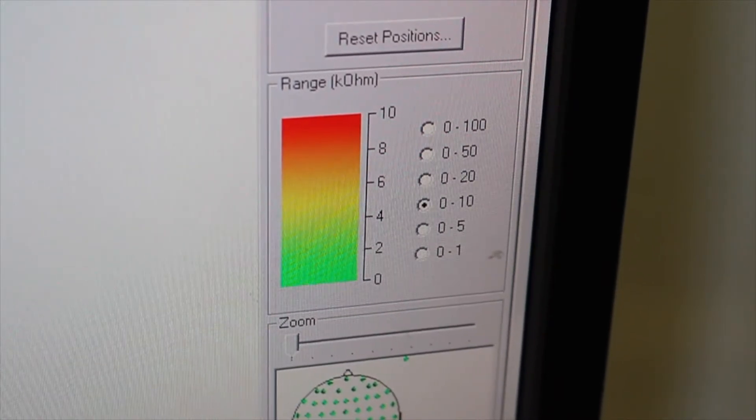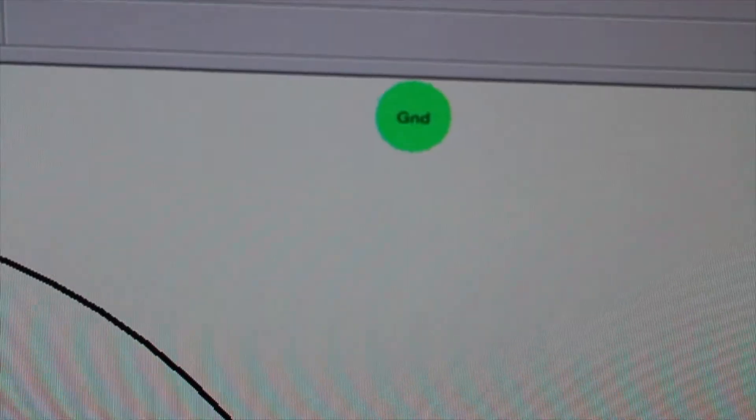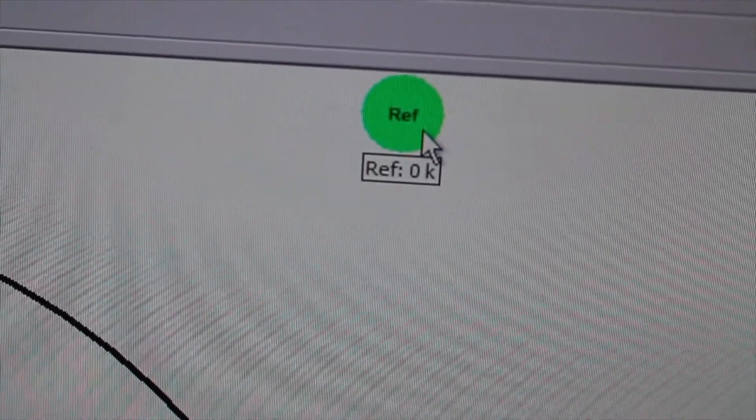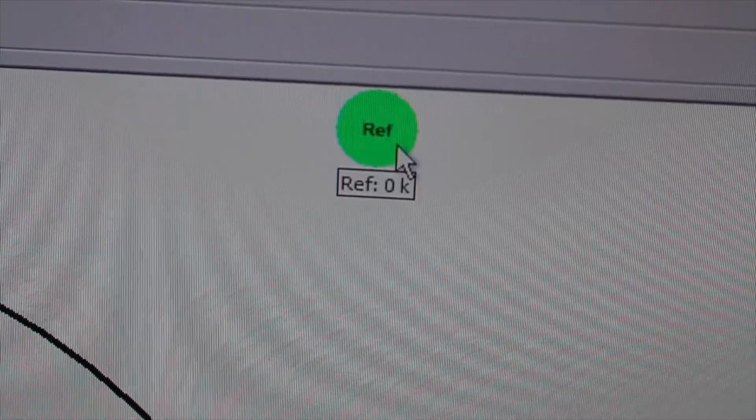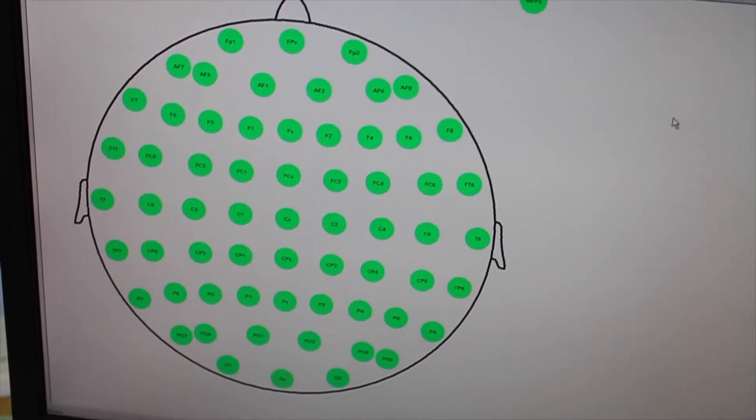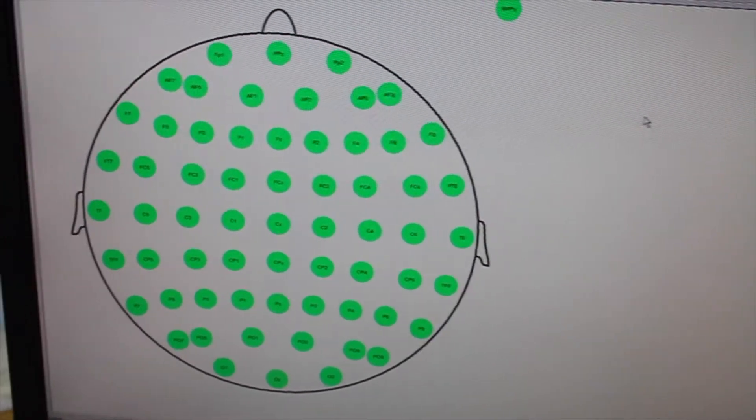However, you should be aiming for under 20 kilo ohms and for the reference and ground to be as low as possible. You can check the exact impedance measure of an electrode by hovering the mouse over it. Ideally, you want to see a nice green display of electrodes such as this particularly good example. You can check the reference and ground by selecting as so.